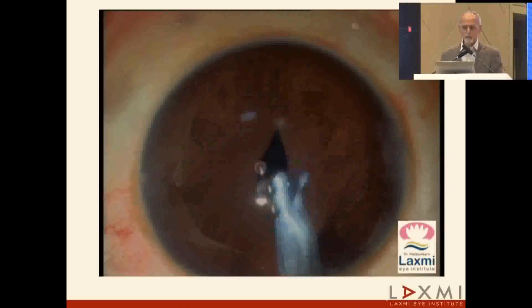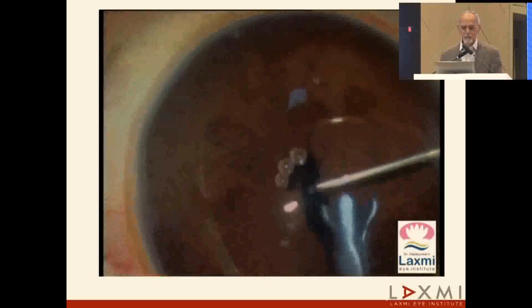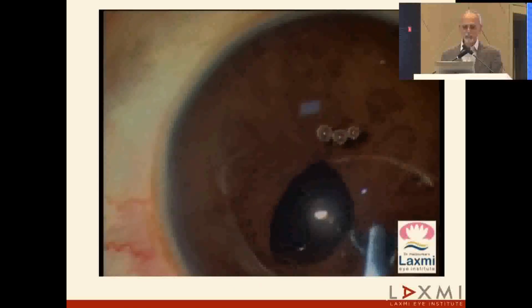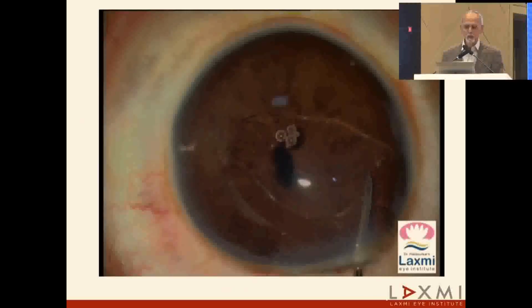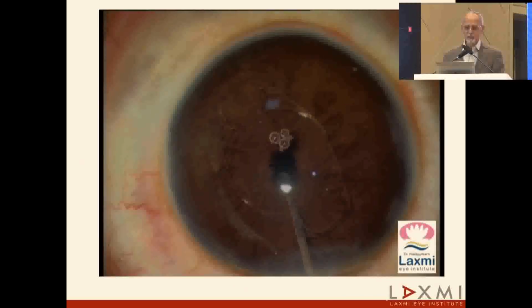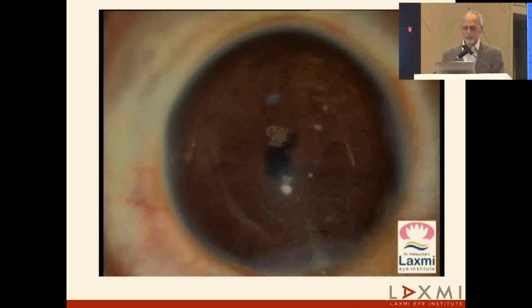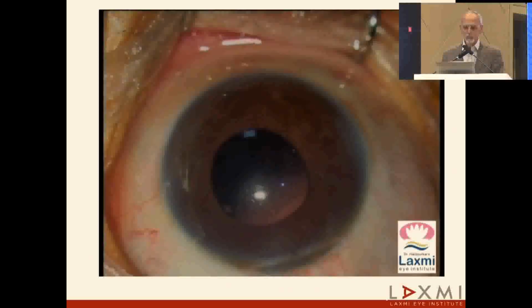Go with the specific forceps, hold the lens, go from the opposite side, very gradually progress, take your spatula through that claw and just try and reverse the procedure, and without much damage, the lens comes into the AC, and then you make a large opening under the visco and take it out. If the lens is defective, you may change it. If the claws are good enough, you can use the same lens.